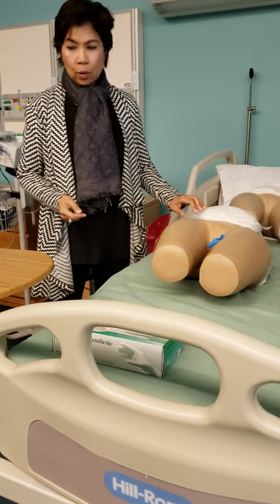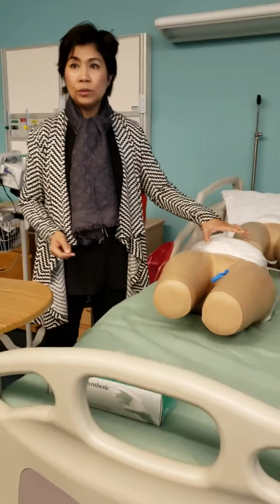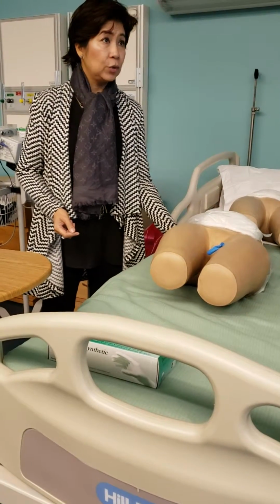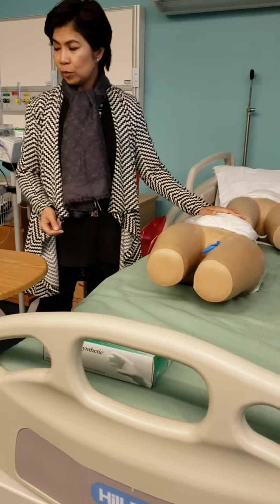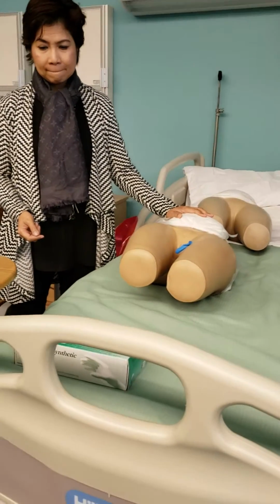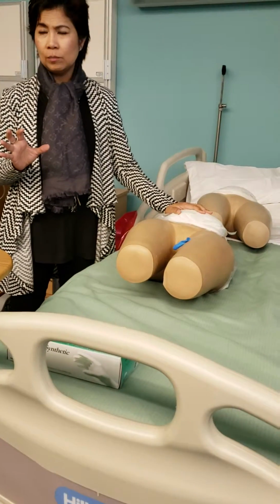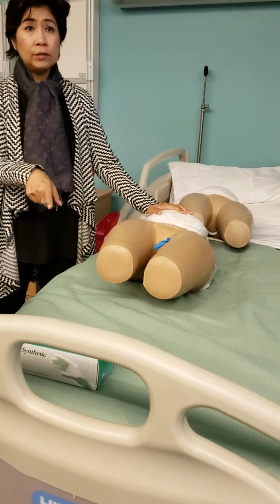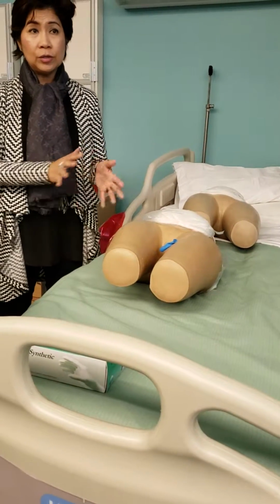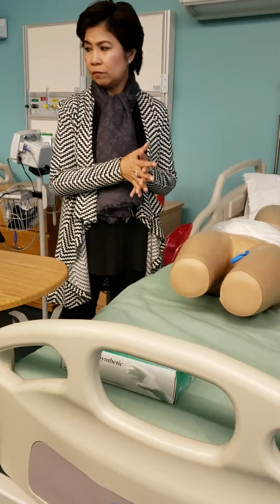Skill. So we have 3 wounds on this dummy: a Penrose one, a suture one, and a decube. All right, so I'll do the decube last. In the clinical setting, I usually use a lot of clean gloves, and I change gloves because they get dirty and moist, so I use a lot of gloves.